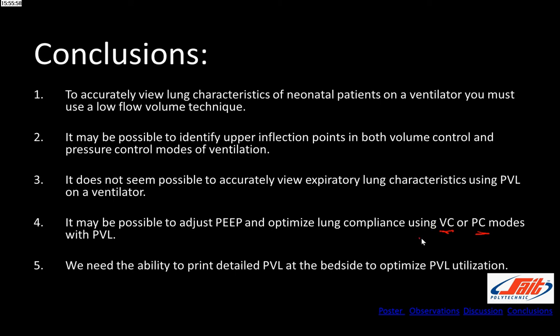But I'm going to suggest that we should use volume control to make sure that we're not either still having a lower inflection point or actually be up over our inflection point, as I showed in my PEEP study in diagram 7. So another aspect of this, to be able to do it accurately, I think we need to get the manufacturers to allow us to easily remove and pull off these pressure volume loops at the bedside and print them up and be able to draw on them and compare them as the patient's condition changes over time, and it might get worse or improve, so we can continuously see where we've been and what we're chasing down with these pressure volume loops.